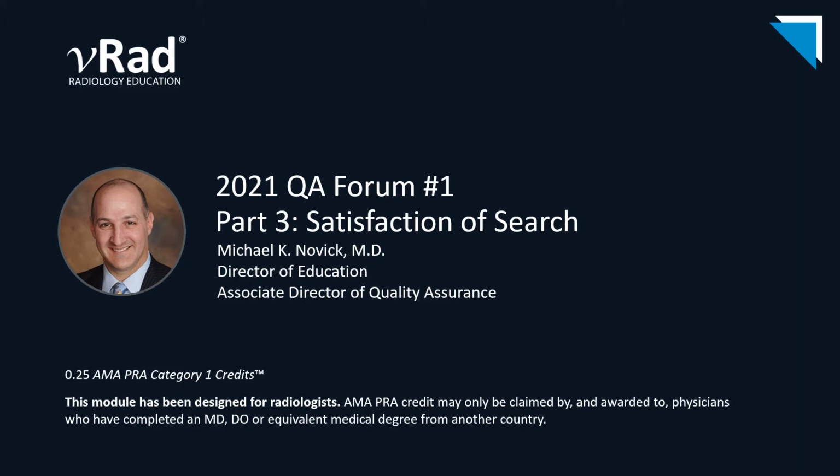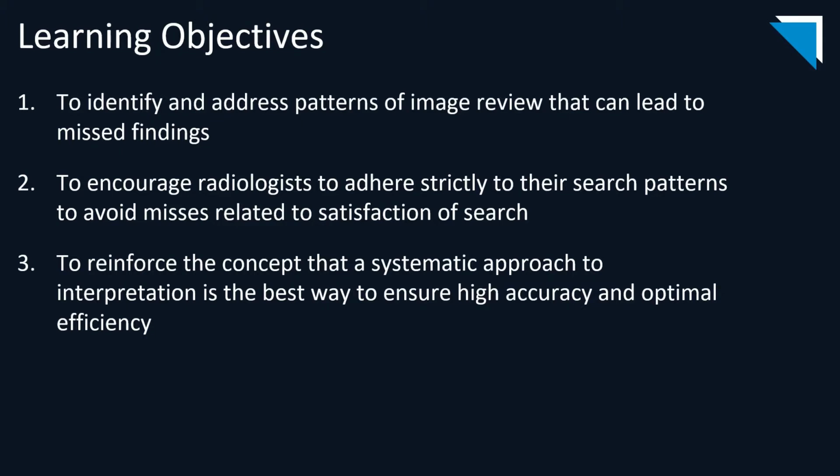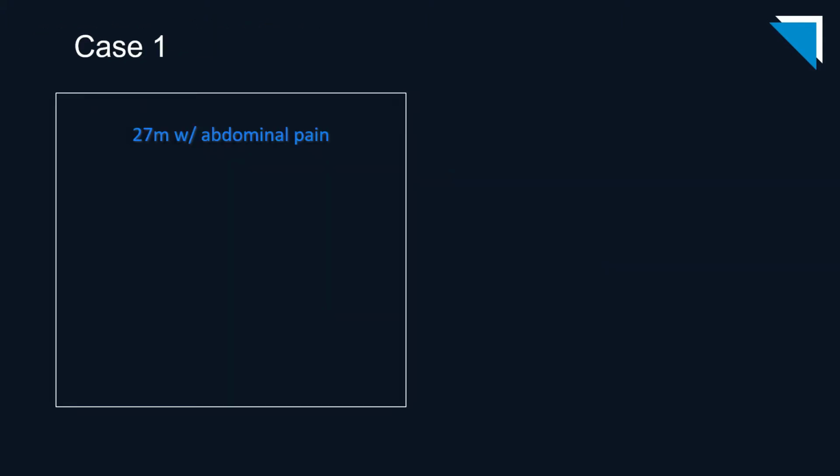Today we'll be talking about satisfaction of search misses. Feel free to pause the video to review our accreditation statement and the learning objectives for this lecture. With the bookkeeping out of the way, let's dive right into our cases.